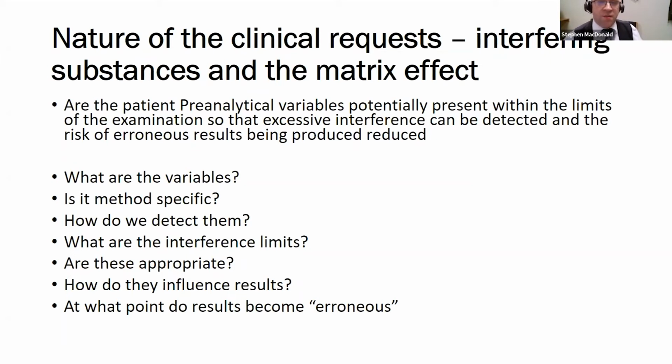However, notwithstanding the fact that that is a real clinical issue in some patients that we are going to be testing, so in intravascular hemolysis, that might be a clinical symptom, a clinical outcome of certain tests that we are measuring, and we still need to be able to produce results in other tests which might be affected by that. And this is a big area of research of how do we interpret and produce results in that context where there may be clinically relevant interferences in the laboratory sample.